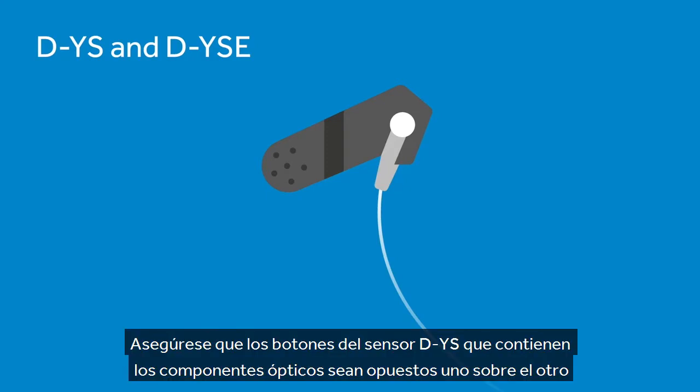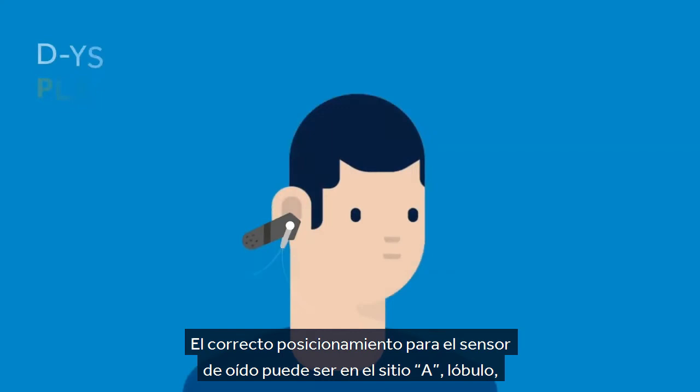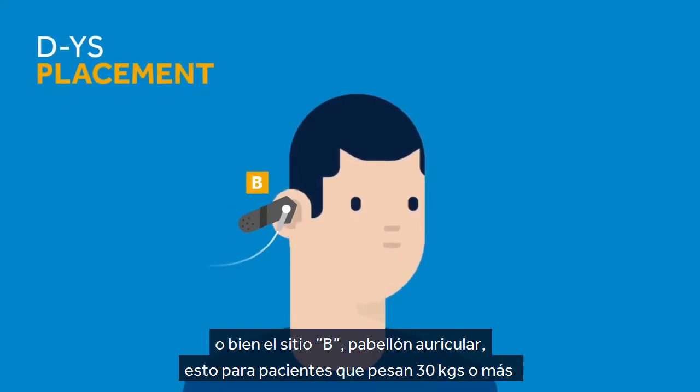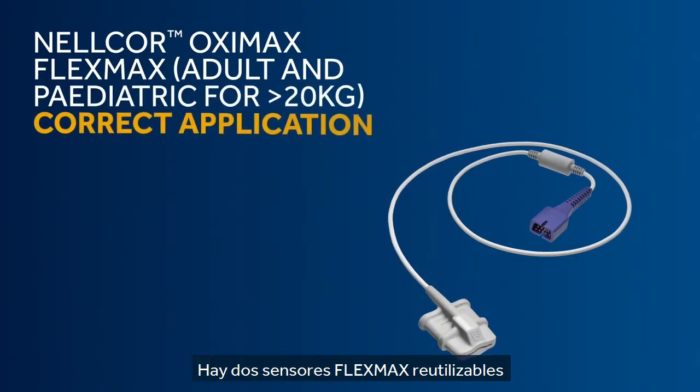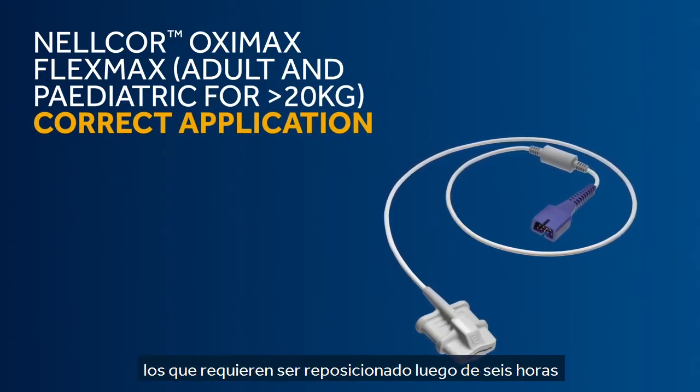Ensure that the DYS sensor pads containing the optical components are opposite one another to ensure optimal light transfer. The sensor is now ready to be applied to the patient. The correct placement for an ear probe is at Site A, earlobe, or Site B, pinna, for patients weighing 30 kilograms or more.